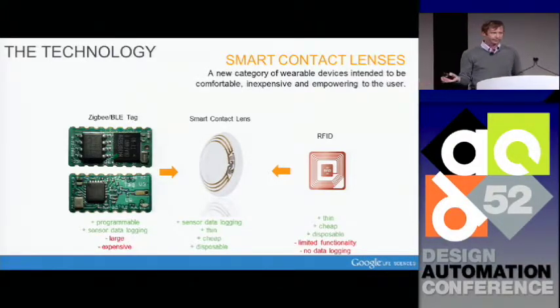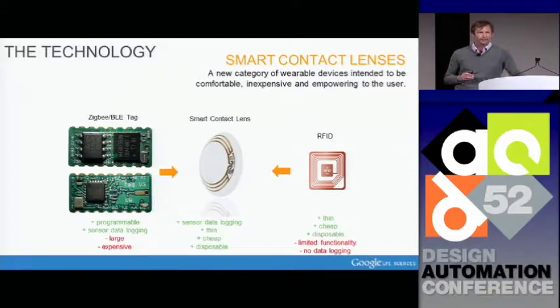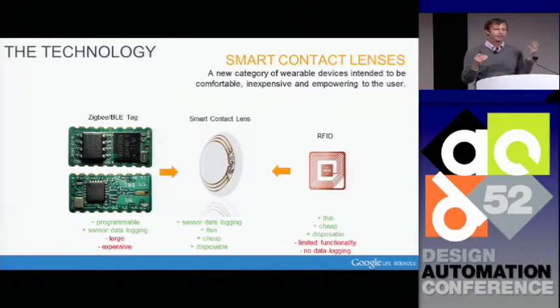It leverages the semiconductor industry to its fullest, including the work that you do, including IC semiconductor fabrication. And these devices are programmable. They can do data logging. They can do whatever you want. The problem is, even if you have a relatively minimalist design, they're still too large. They're still too expensive. It just doesn't make sense to think about taking something on a PCB and putting it into a contact lens. It's a total non-starter.